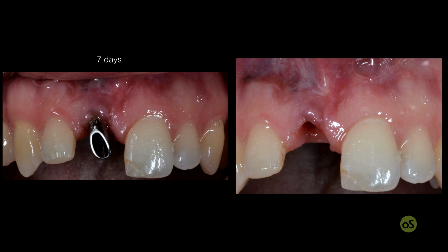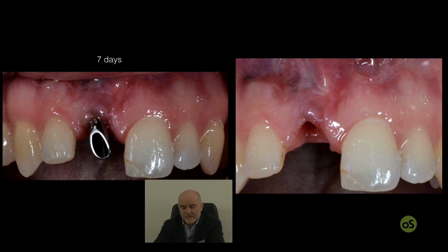In these seven days before the patient gets to us, the crown was removed, the old abutment was removed, and an impression of the platform of the head of the implant was given to the technicians to prepare the narrowest, the smallest, the thinnest abutment possible. When I speak about narrow, I mean that we have to use an abutment that is no more than the screw that connects the abutment to the implant.